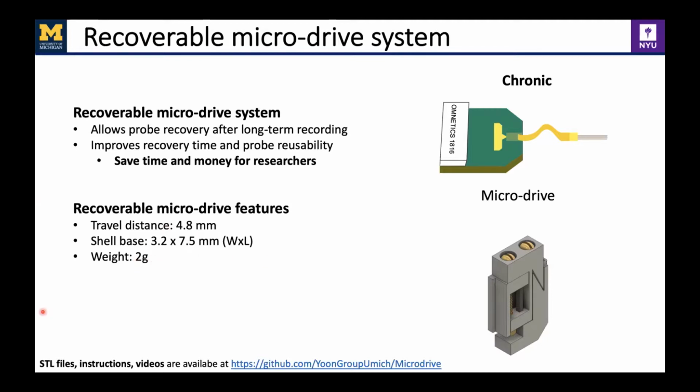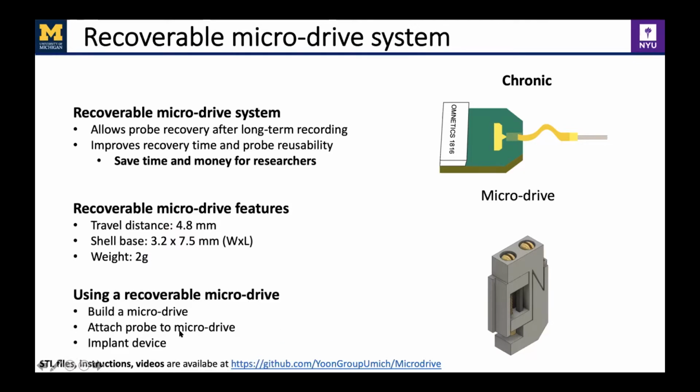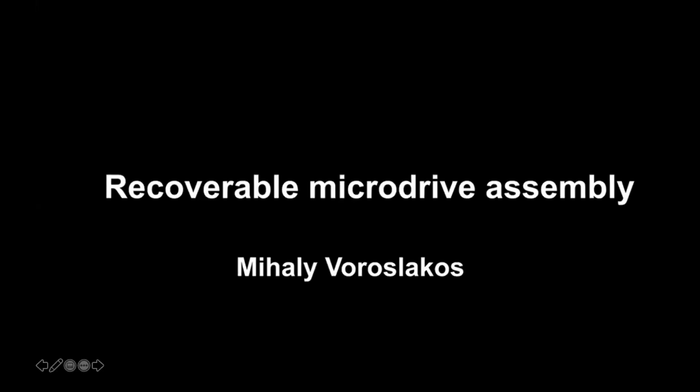And next, I'm going to show you how we can build a microdrive, attach a probe to the microdrive, and then implant this whole device into the brain.